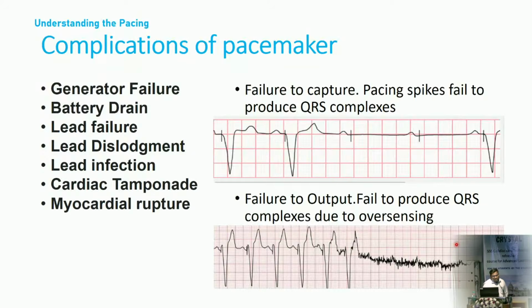So complications of pacemaker: generator failure, battery drain, lead fracture, lead dislodgement, lead infection, and tamponade and myocardial rupture. This is again just two examples which I gave you.